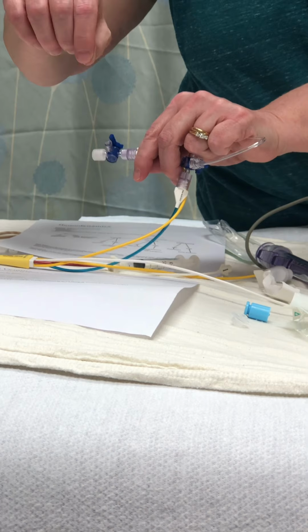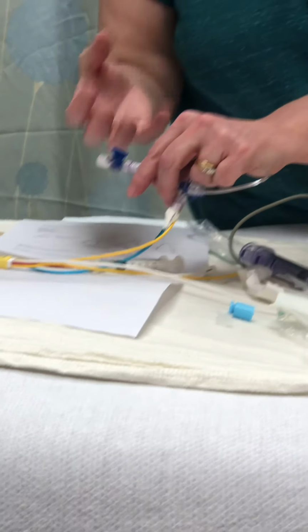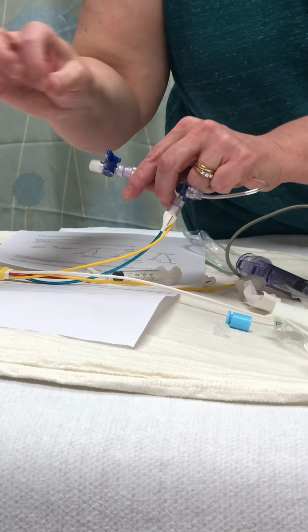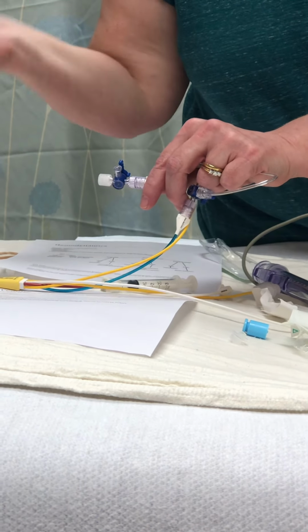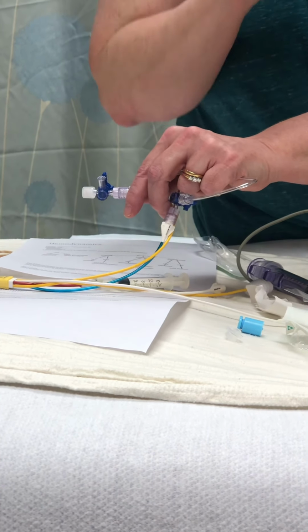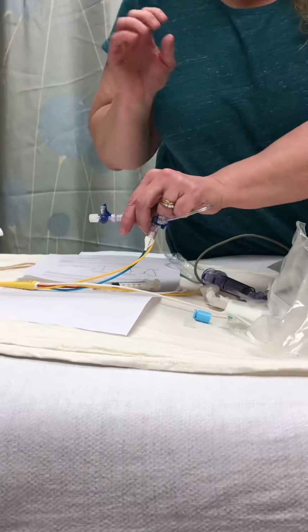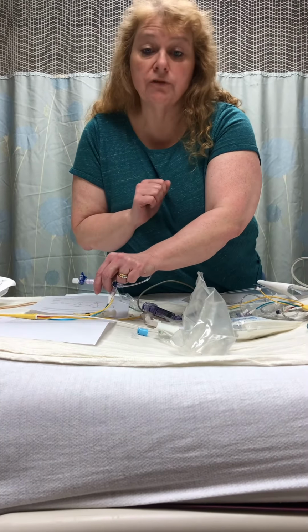You're going to withdraw with the syringe, and you're going to go slow because you don't want to over-extract the oxygen. You're going to waste first 5 to 10 cc's, and then draw it as a gas. When you put in the order, it's going to be a venous gas, and respiratory will draw it. Then just make sure you're flushing your line afterwards.